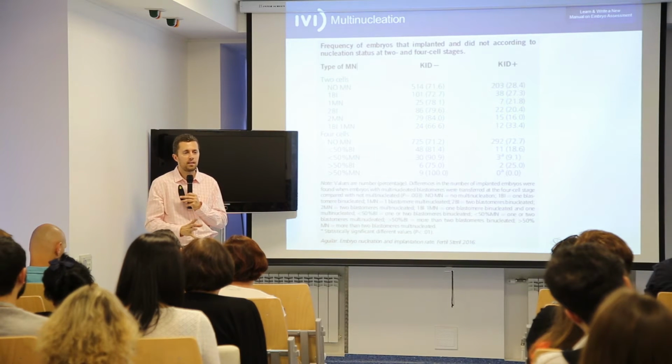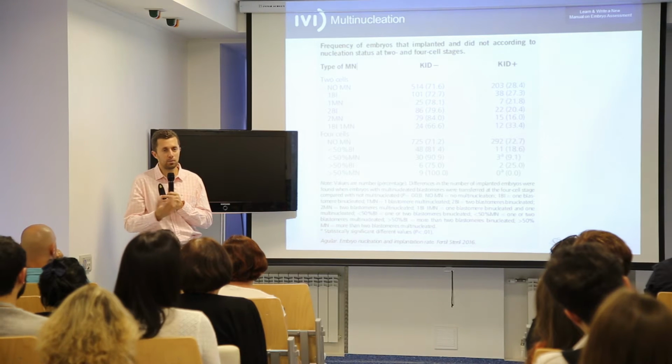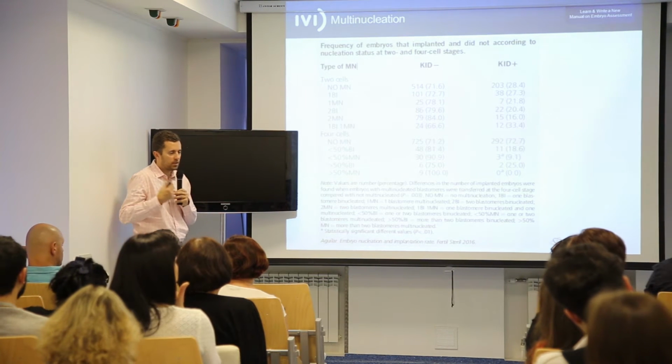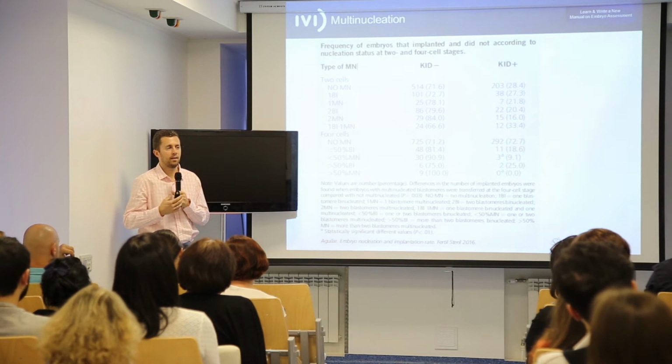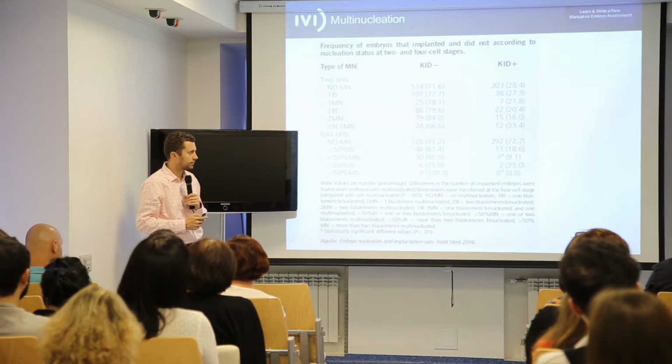I mean, it takes time and also the optics of the time-lapse system should be good. I don't know if all the time-lapse systems will be able to manage this presence of multinucleation at the same level. In our experience with the Geri, with the EmbryoScope, it looks that it's relatively easy to detect, but it takes time, so it's time consuming.